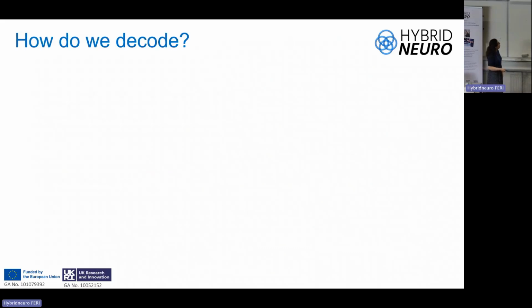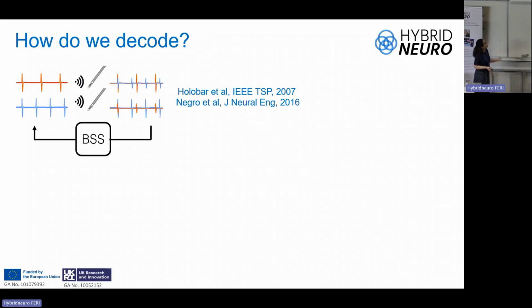signals. But you have heard a lot in the past days about blind source separation, and the mixing problem is similar. So the idea was, why not apply blind source separation to our signals as well? These algorithms you are very familiar with are defined blind because they don't make assumptions about the signals. You know nothing about the experimental protocol.